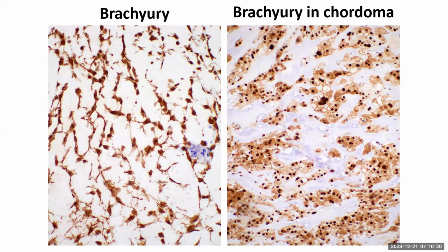I find this a little odd and difficult to interpret, because in my practice and in the literature, chordoma distinctly stains with brachyury specifically, and the imitators of this situation is really not there. So it's difficult to interpret this background staining, probably a trick of the immunohistochemical labeling at that time. That wasn't my case, so I don't remember it very well.